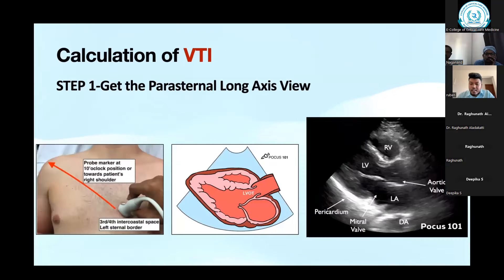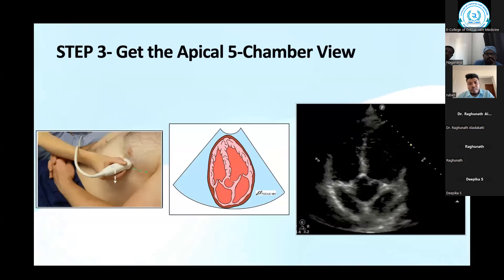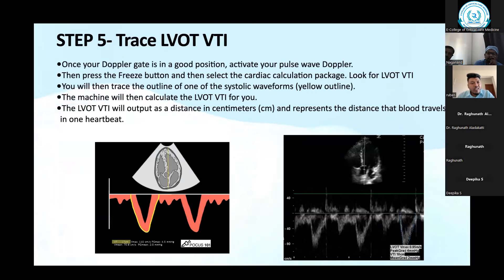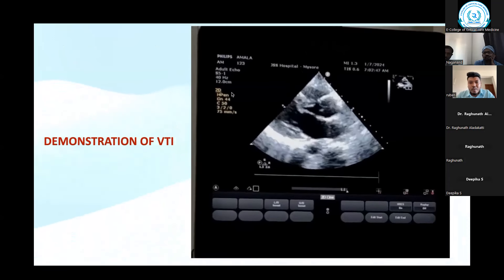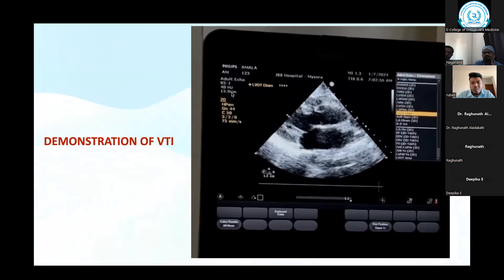Summary of steps: Step one — parasternal long-axis view. Step two — measure LVOT diameter with valves maximally open, freeze and measure. Step three — four-chamber view, tilt to three o'clock, get five-chamber view. Place pulse wave Doppler at the aortic valve opening. Press pulse wave Doppler, get wave tracing, freeze, press measure, trace the area. This is a video done by our echotechnician at JSS hospital — more accurate because they do this daily multiple times.